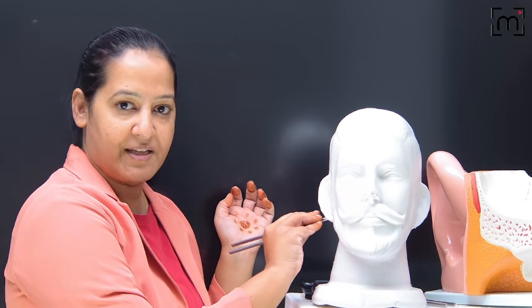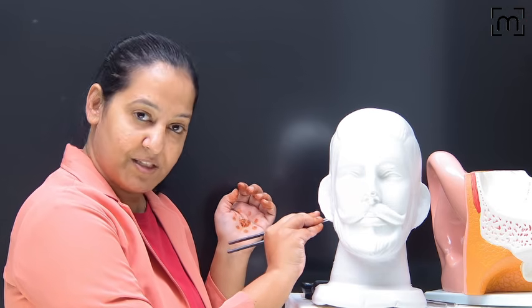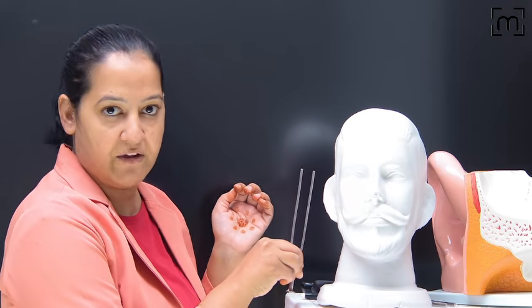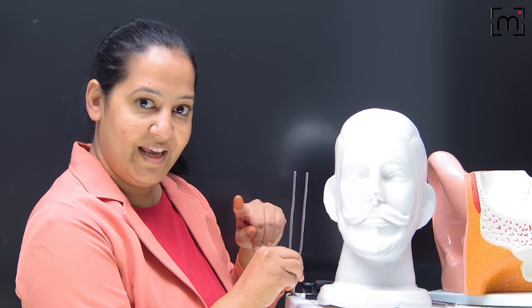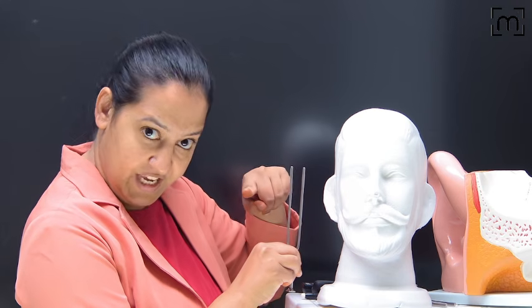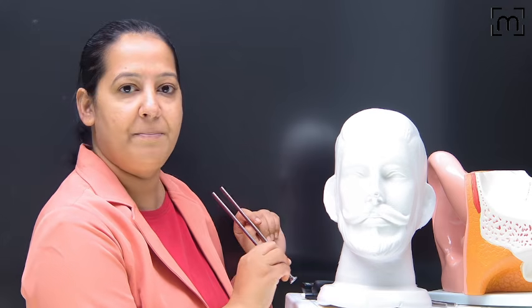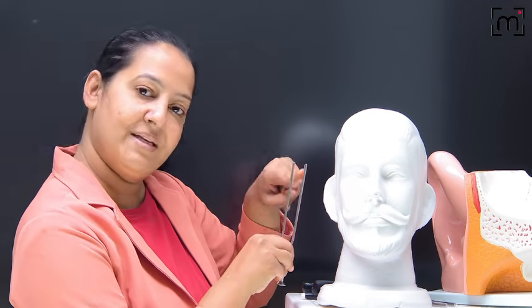So this is my tuning fork. I'm activating it. First, keeping it on the mastoid, asking the patient to feel the vibration. As soon as the patient says the vibration has stopped, immediately I will shift the tuning fork over here. So normally AC is greater than BC, so the patient should still hear it after stoppage from the mastoid. Yes or no? So normally AC is greater than BC. In sensory neural deafness also AC is greater than BC.